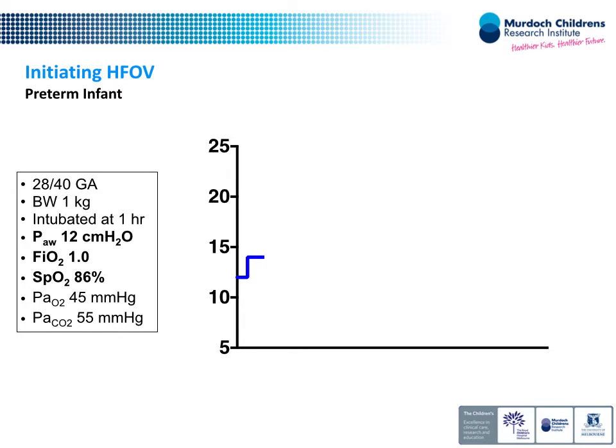If you think as a physician that what you see with this baby is what you would expect, because the baby is preterm, no antenatal steroids, you would expect RDS, then I would probably not make the X-ray. On the other hand, if you say, well, these settings are actually quite strange. This is a lot of oxygen. Maybe there is some pulmonary hypertension. Maybe this is a baby with ruptured membranes for, let's say, more than normal.